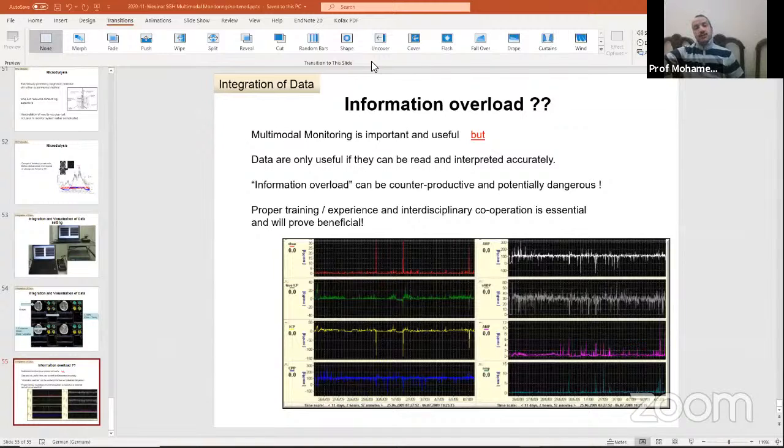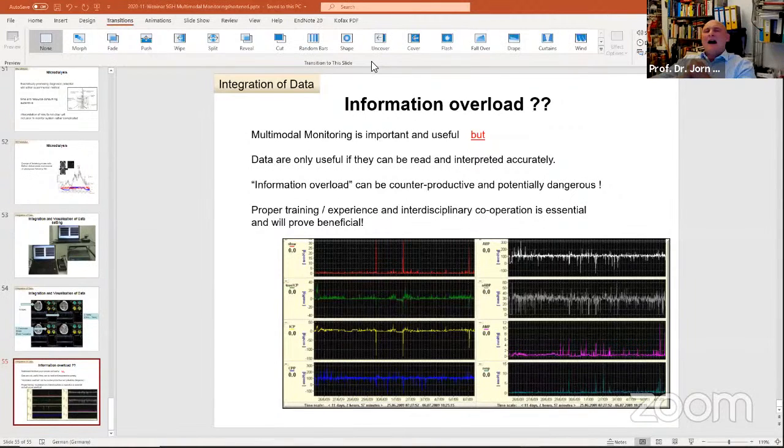We have another question from Ines. Can electrogram detect the oxygen consumption of the brain and the oxygen pressure? She's asking if the EEG will help. Well, it is interesting because there is a spreading depression. That's what that probably points towards. There are some studies about electrical phenomena on the brain, and they are useful. You can detect changes in the brain metabolism, let's say it like that. But I wouldn't automatically do an EEG.